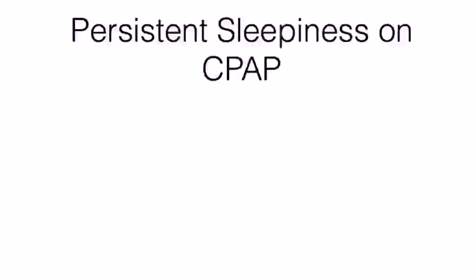The download data will show you what the AHI is. The AHI is the apnea-hypopnea index, which is a measure of severity of their sleep apnea. Ideally, you want it to be less than 5. However, there are some patients that may not respond well to CPAP due to mask leak, for example, and require change in mask. This occurs especially in patients who are mouth breathers that use nasal masks initially.